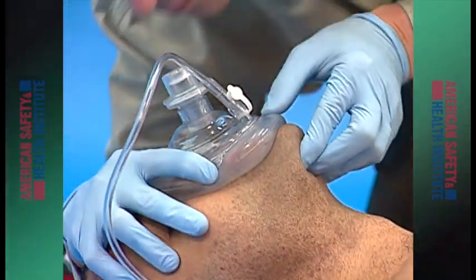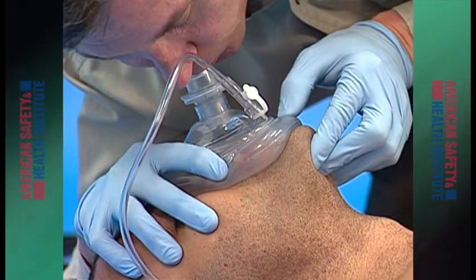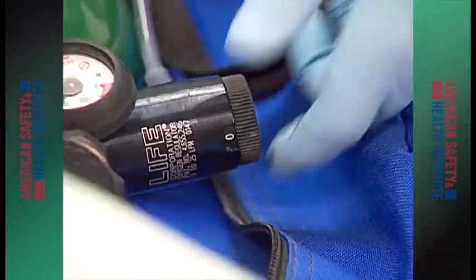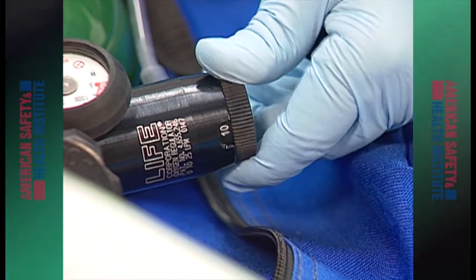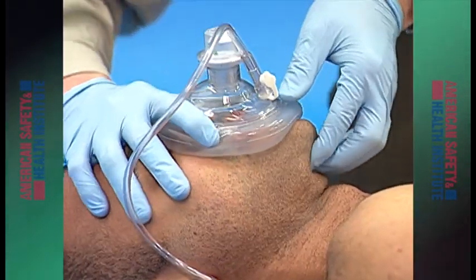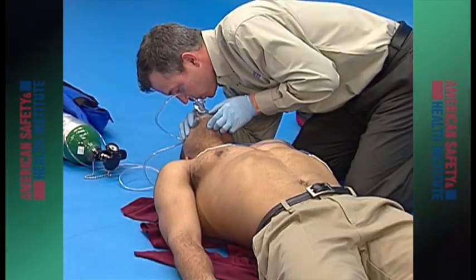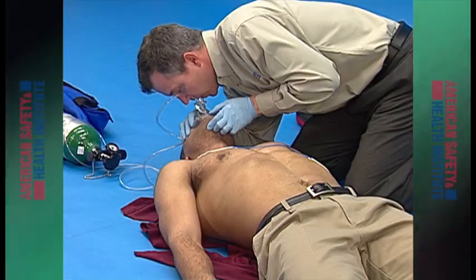Masks are clear to detect vomit or other foreign material and are equipped with a one-way valve for protection from disease transmission. Use the highest flow rate available, between 6 and 15 liters per minute. Establish an airway before ventilating and make sure you see a visible rise of the chest on every ventilation.